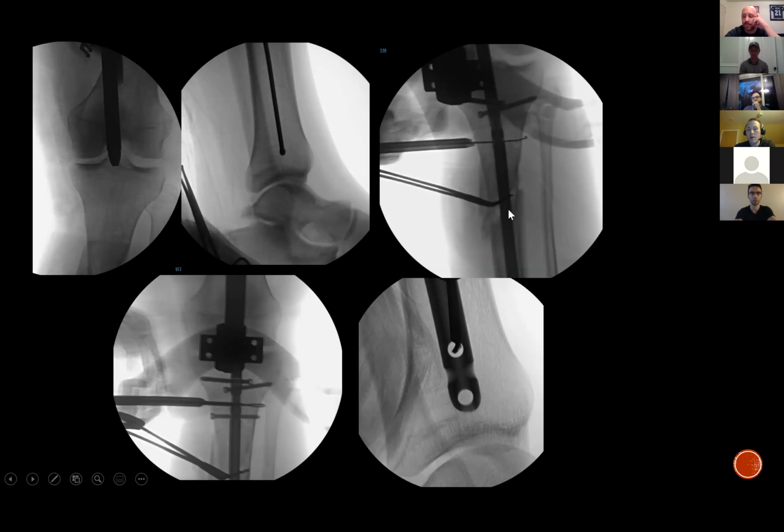Here we are. We have a clamp on the fracture site. There were not as many fluoros saved for this case. I wish I could show you guys more, but there just weren't more images. But there's a clamp on this fracture site in order to reduce it before we had reamed, before we put our nail down. This is a depth gauge that we've inserted. Using a little hook on the depth gauge, we can feel the far cortex, and then we can measure how large of a nail, a cross-lock bolt or an interlock screw we have to put in.